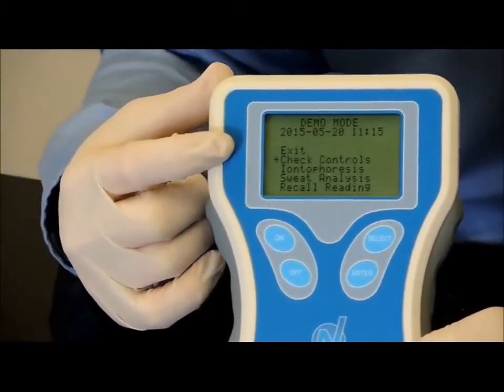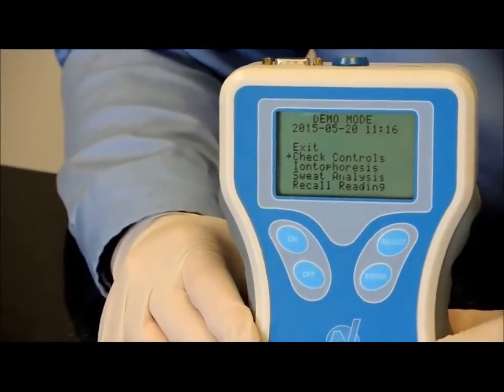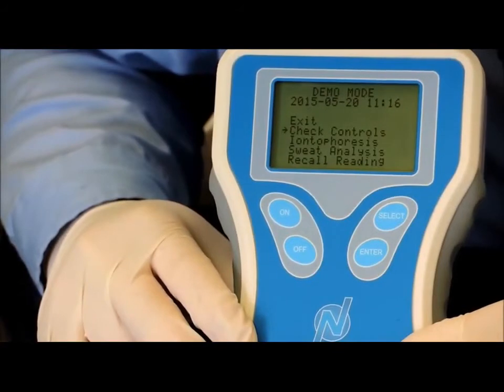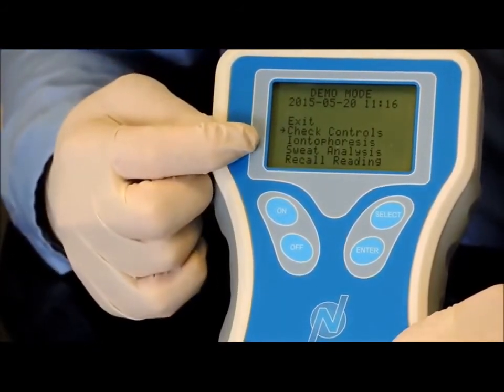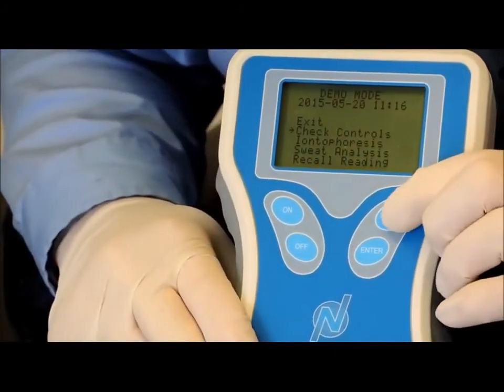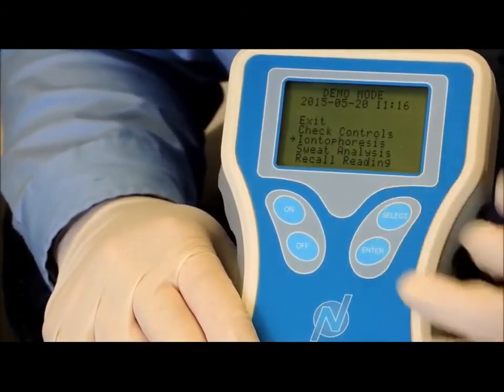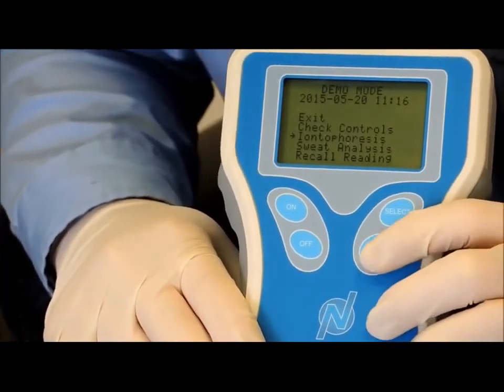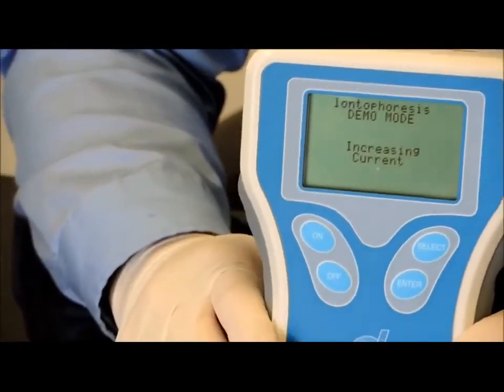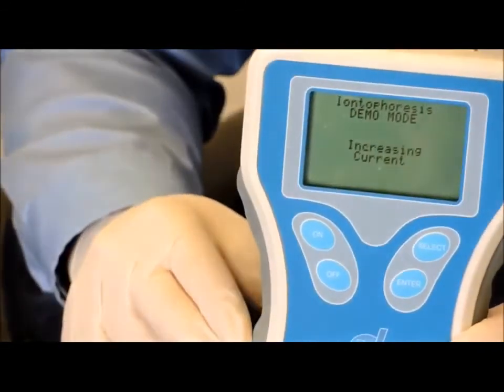So now this takes us to a screen. It does say demo mode at the top, but the screen looks very similar to the normal screen that they have if it's functioning properly. And so you have check controls, iontophoresis, sweat analysis, and recall reading. I'll skip past the check controls and select down to iontophoresis. So now at iontophoresis, I can show a customer or a patient what the instrument will do during iontophoresis without being connected to the patient.